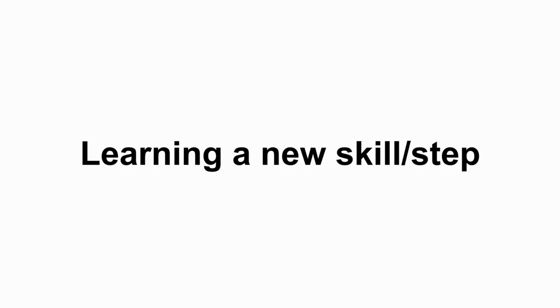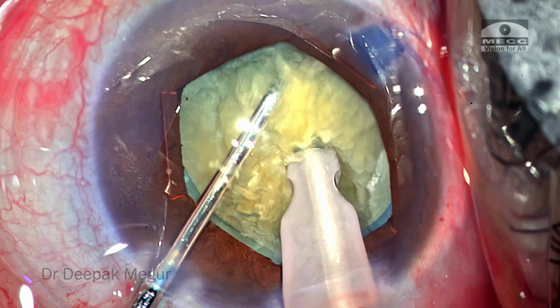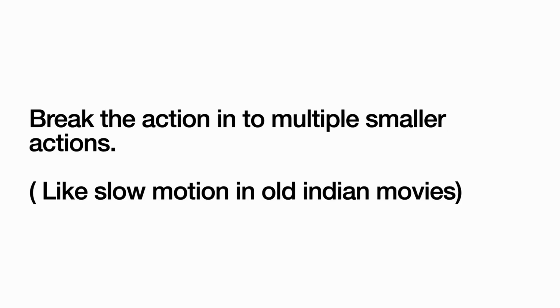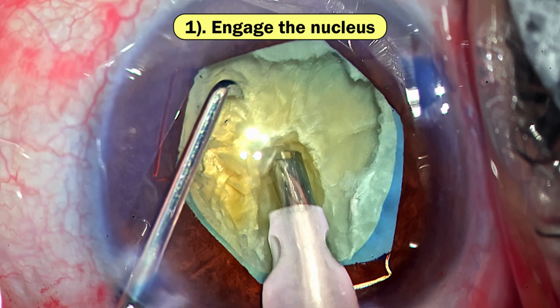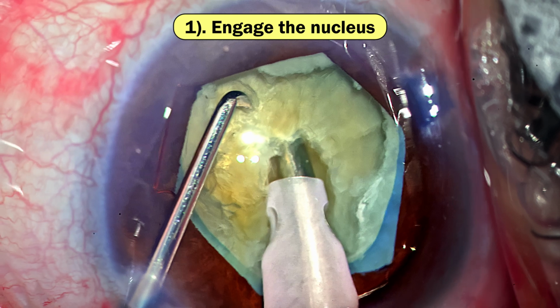So let me take you through another step, where somebody wants to learn a vertical chop maneuver. This is the vertical chop done by an experienced surgeon. You just go in, hold the nucleus and chop it. Let me try to break this maneuver into multiple small maneuvers, okay? Number 1, first engaging the nucleus itself. So the foot pedal goes to 3. There's a short burst of energy which is given.